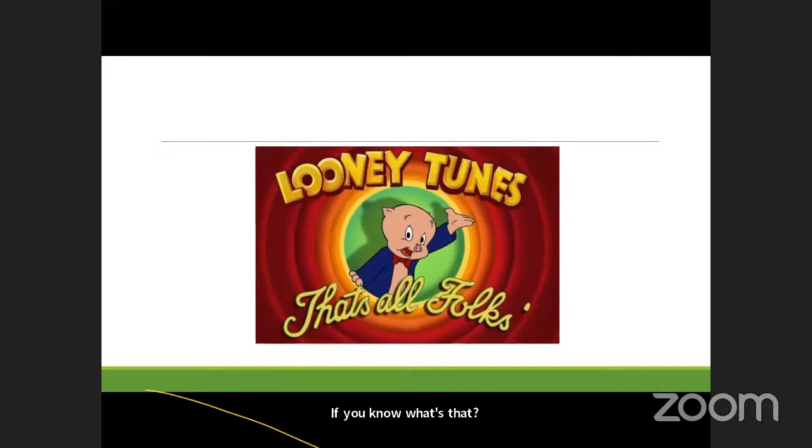I have one question. On the last study, there was a very interesting finding where you mentioned there was worse outcome when they did the airway intervention. Was there any data in the study to suggest how long they took to do the intervention? Not in this study. I've seen other studies that comment on that, and I don't remember off the top of my head. But it is one of those situations where the recommendation is do not pause compressions to insert the airway. Try to get the airway through the compressions. The compressions are the thing to focus on.